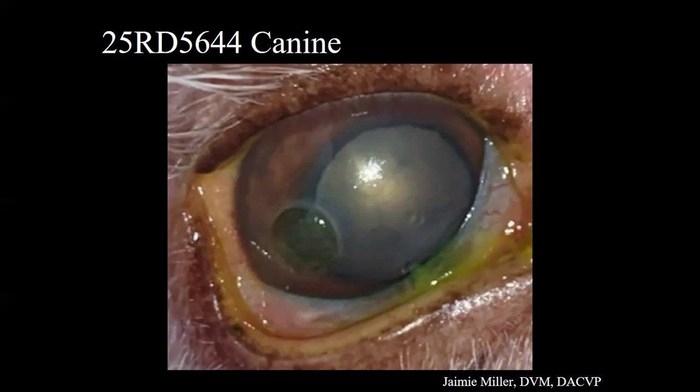And let's see, grossly, we did say that the globe was slightly collapsed. And we saw the corneal perforation, said it was slightly leaking and partially plugged with tan material, and that we noticed that there was some anterior synechia to the perf, so some iris prolapse. So got some nice histology stuff to show.